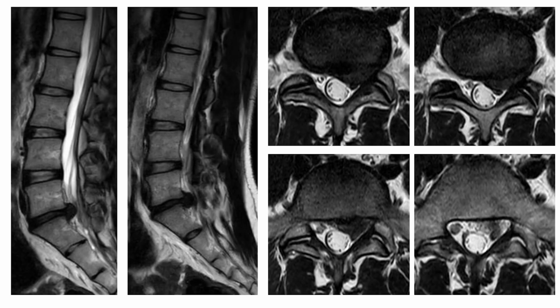So this is the second MRI, 4 months apart. You can see here the disc prolapse on the left side has increased. There is a big fragment now, a sort of contained fragment here. So now our plan in this case is to do left-sided interlaminar endoscopic discectomy, monoportal. We are not going to do bony decompression in this patient because of the wider interlaminar window, which I am going to show you in the X-ray.